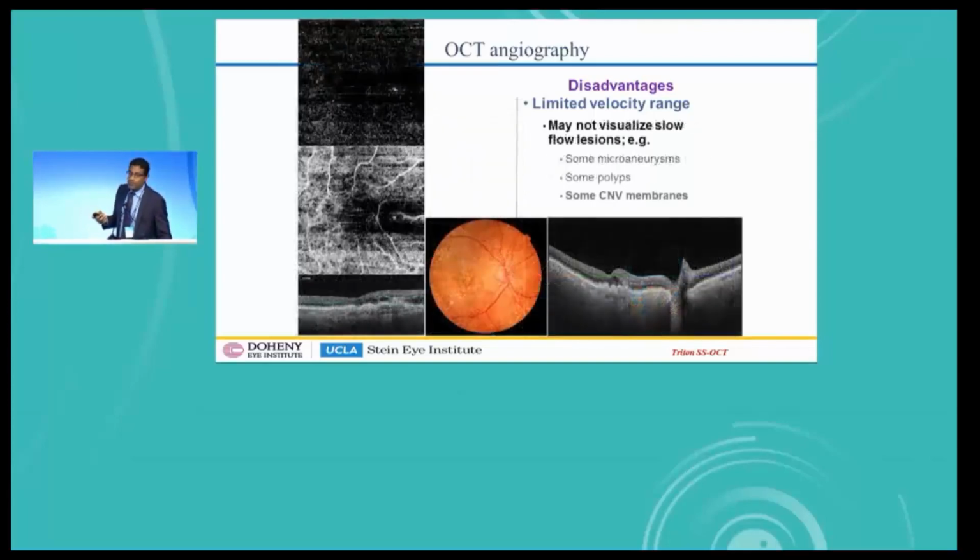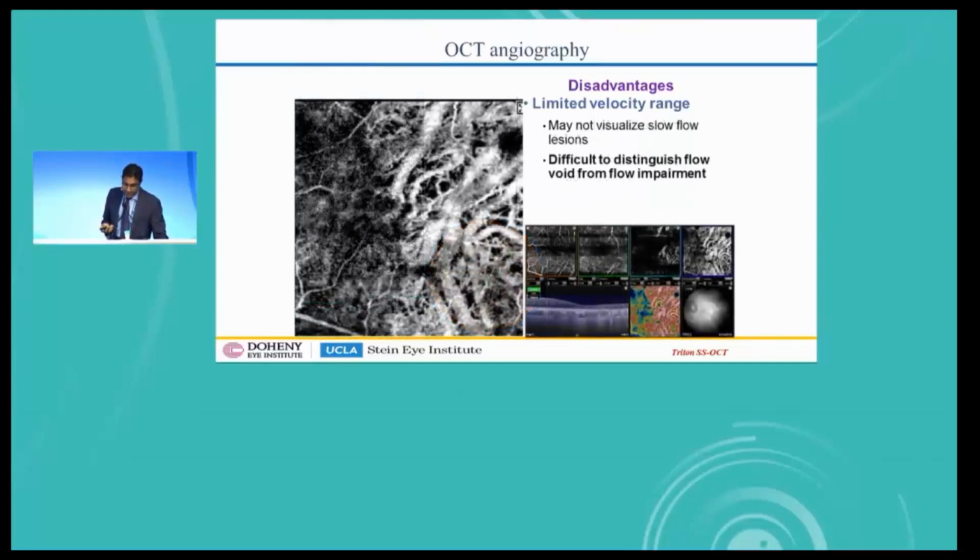I will say, though, and Michael also pointed this out, specifically in patients with pachychoroid diseases that Rick talked about, sometimes you have chronic pachychoroid changes, a lot of RPE alterations. It's hard to tell, is there actually leakage on the fluorescein? This is where seeing the vessels on OCT angiography can be very powerful.